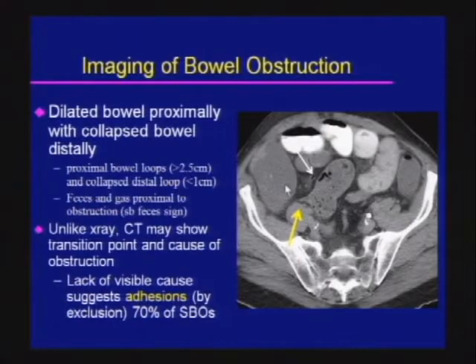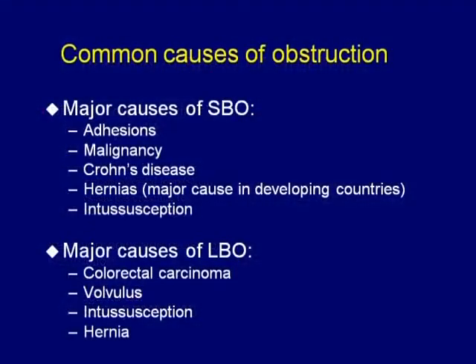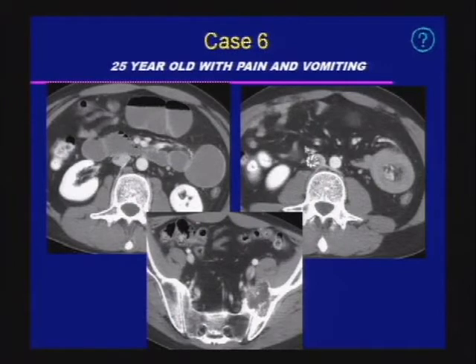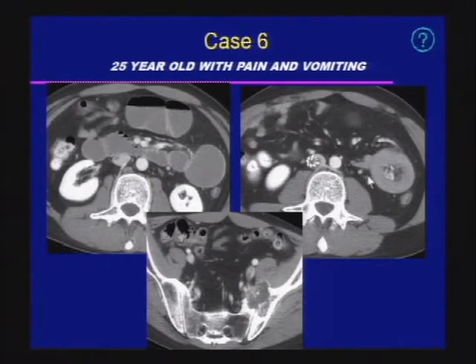Adhesive disease is responsible for about 70% of all small bowel obstructions. Case six: we see dilated loops proximally and decompressed loops distally. Looking at the transition site, there is an intussuscepting mass at the site of the small bowel obstruction.